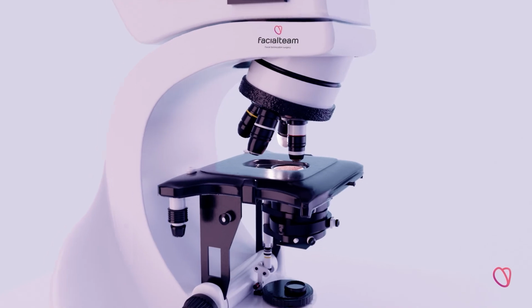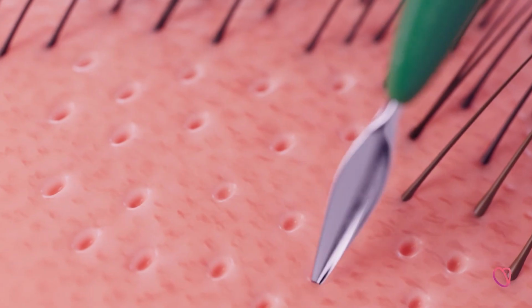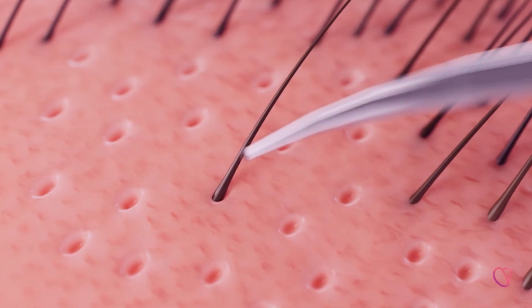First, a team of technicians extract the follicular units from the strip. After grafting sites are prepared, the follicles are placed for a natural, dense, and more feminine hairline.